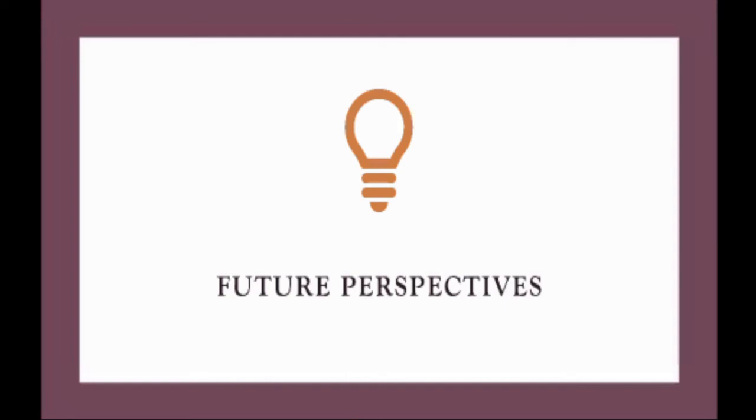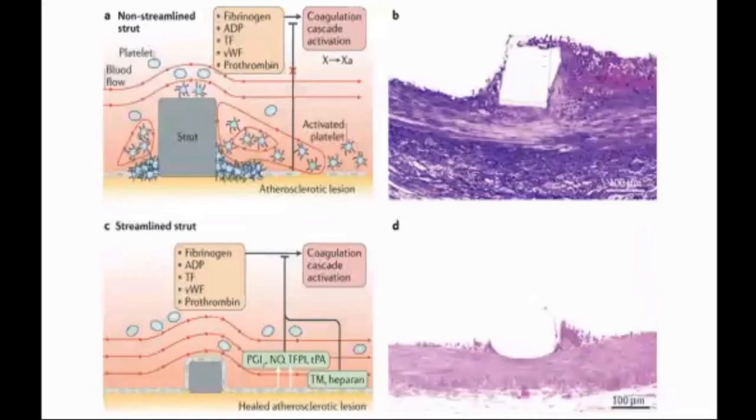Currently, stents are mostly produced by laser cutting or other fabrication techniques like electro-discharge machining, water jet cutting, photochemical etching from tubing, and various wire forming techniques such as braiding and knitting. However, these technologies can be updated or replaced through advancement in augmented reality, 3D printing, and deep learning. Specifically, by making use of the information gathered about blood vessels through AR and DL, materials like polydioxanone and metallic glasses can be 3D printed into cardiovascular devices with more distinct design than commercially available ones.